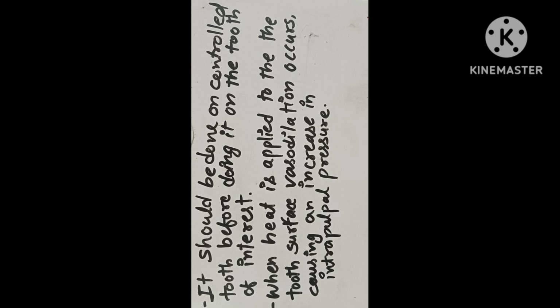When heat is applied to the tooth surface, vasodilation occurs, causing an increase in intrapulpal pressure. It should first be done on a control tooth, meaning a normal tooth, then it will be done on the tooth of interest, meaning the tooth on which the patient complains of pain.